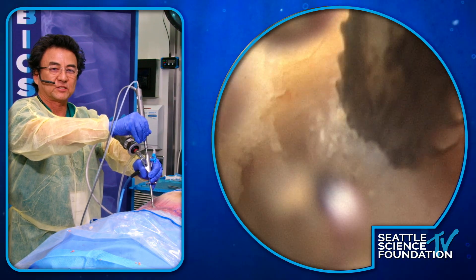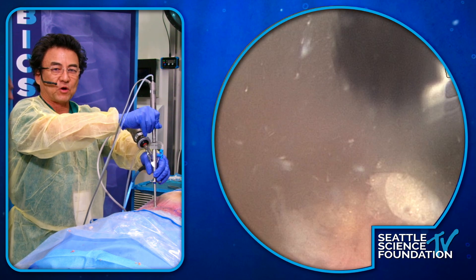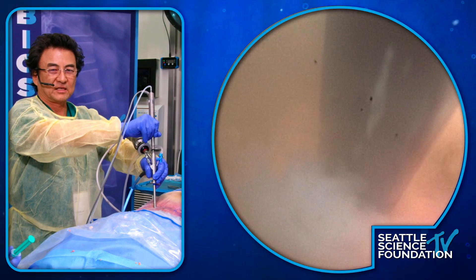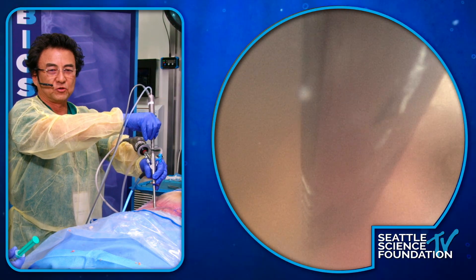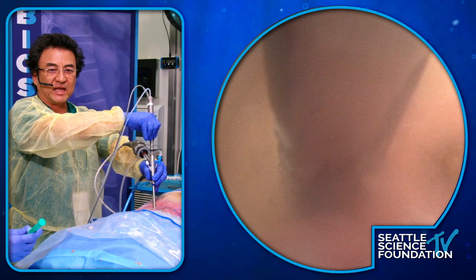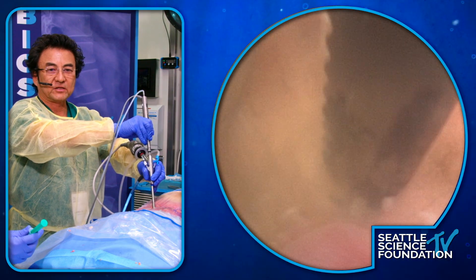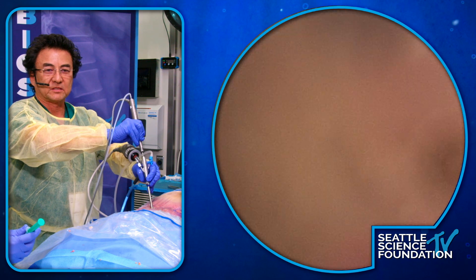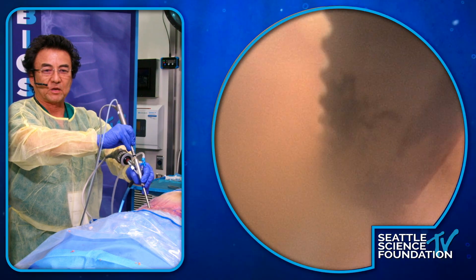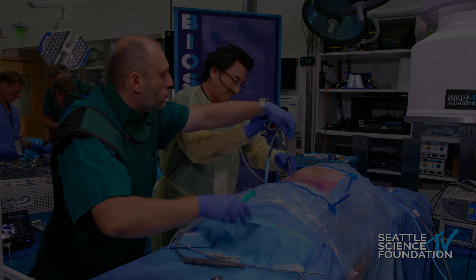The visualization is much easier with this tool. It's a very different feel — like the difference between skiing and snowboarding: it looks the same but it's two totally different sports. In the cadaver lab we should do a transforaminal approach to L5-S1 and do a facet resection. I think it'll be more interesting for you guys to play with it yourselves, because the feel and performance profile is really different from the burr. There are times where I have both the burr and the ultrasonic blade, but if you're budget-conscious, you probably just want to pick one or the other. Thank you — that's a great demonstration of the ultrasonic scalpel.